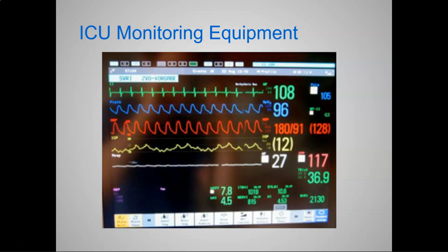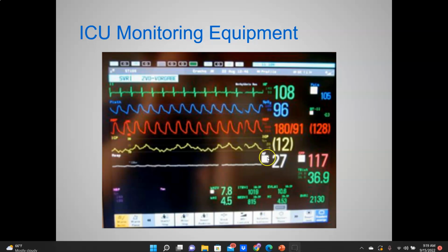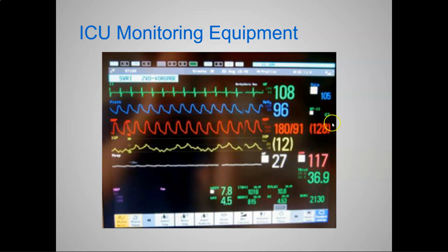Okay, down there we have 27. We have our respiratory rate. All right, we have the mean. We have all sorts of cool stuff over here. We have temperatures, I believe. Yeah, we have temperature. There's a lot of numbers here.